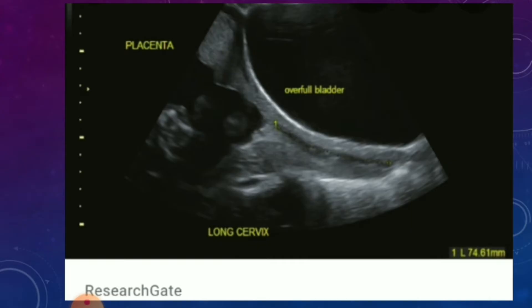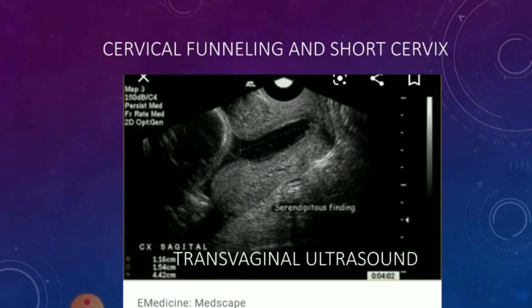Another pitfall would be a concentric lower uterine segment focal myometrial contraction, which can cause a funneling appearance, but you'll still have normal cervical length. If there's any doubt for cervical incompetence, you have to do a transvaginal ultrasound to confirm that.